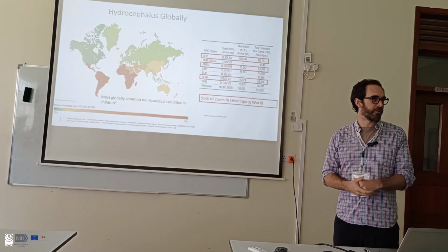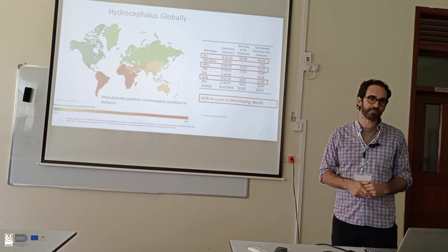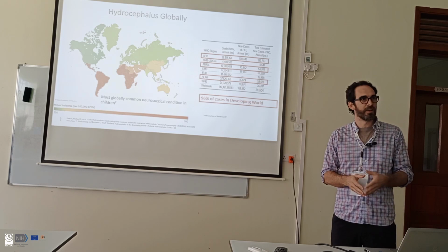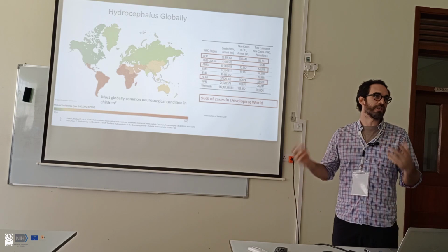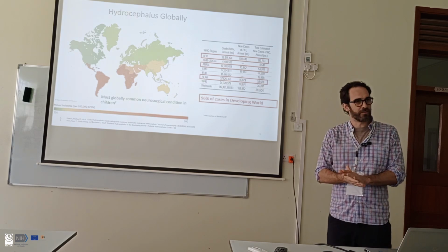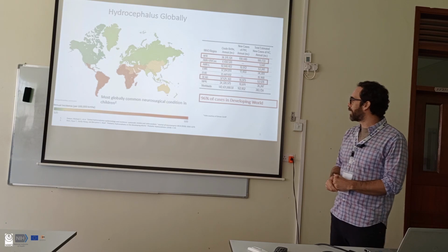They got curious about how to treat them better, and that started this study. Then they noticed that only CT was available to image these infants, and wondered, wouldn't it be great if we could use MRI? That's how they started pushing for low-field MRI technology as it relates to hydrocephalus. Really, that's the root of why I'm here, for sure, and John's as well, I believe.